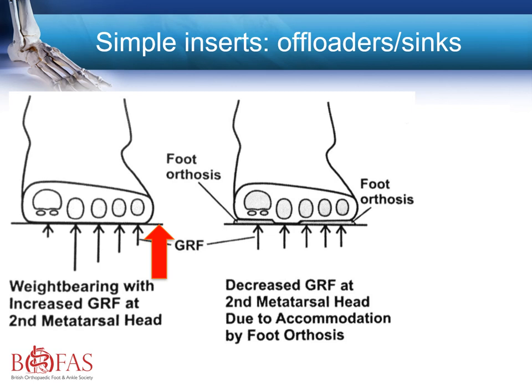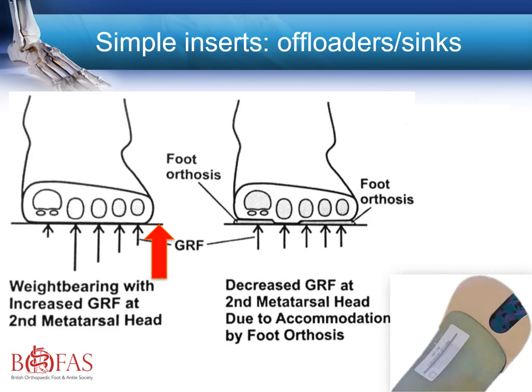This next diagram in the coronal plane also shows offloading, and in the bottom right it will appear the insole, which shows the softer material in the area of second metatarsalgia.